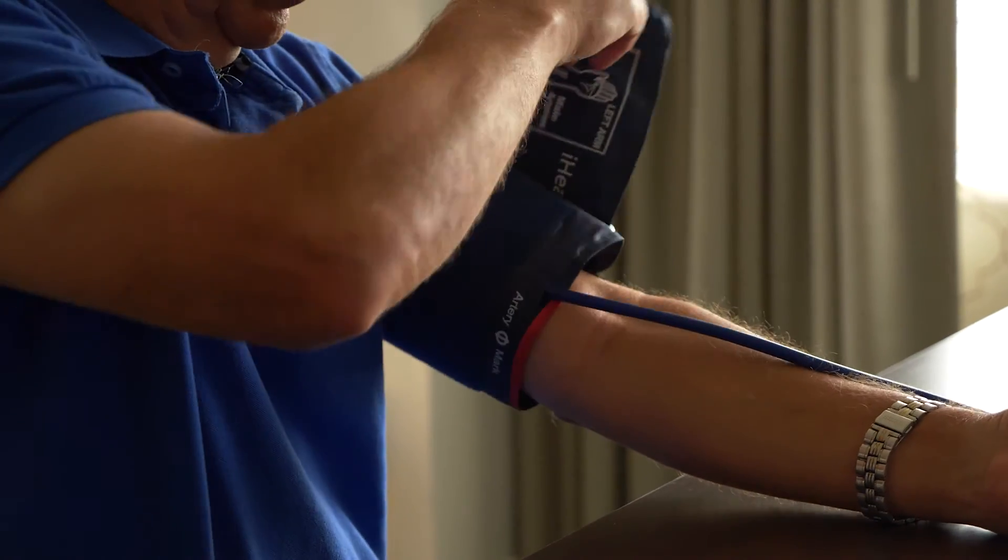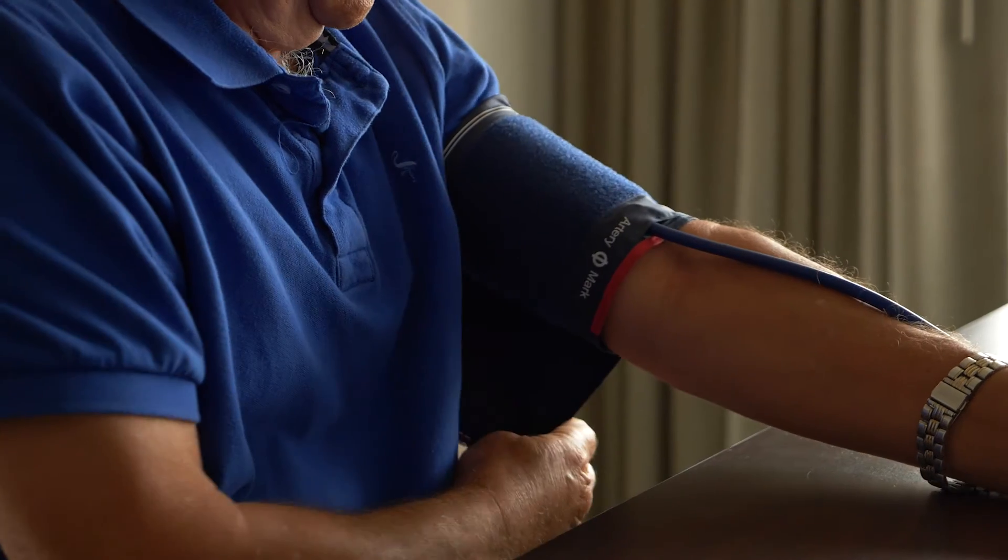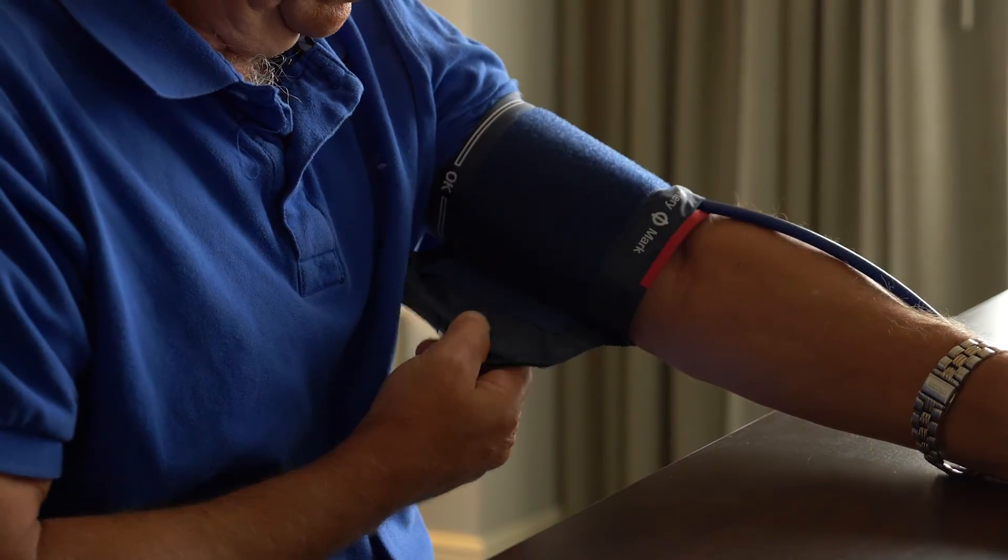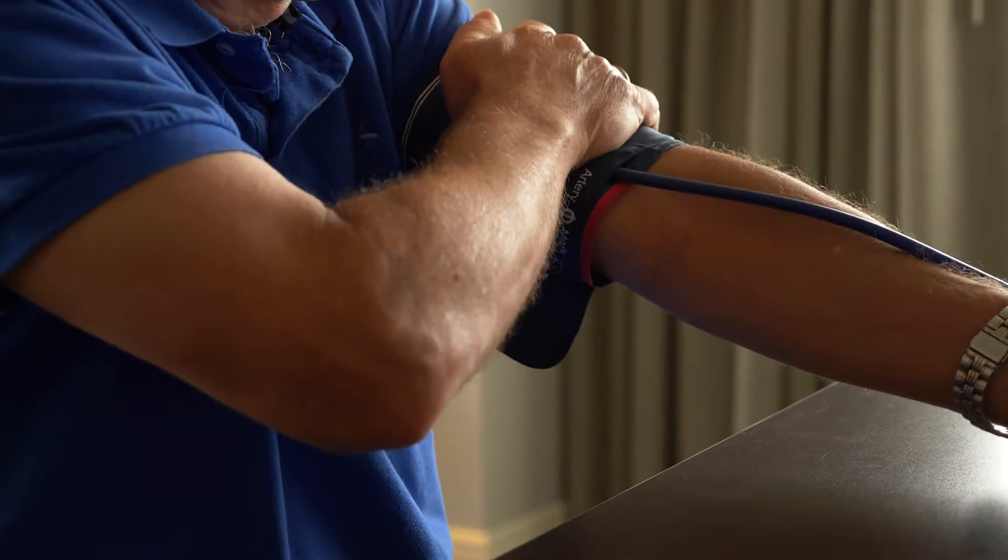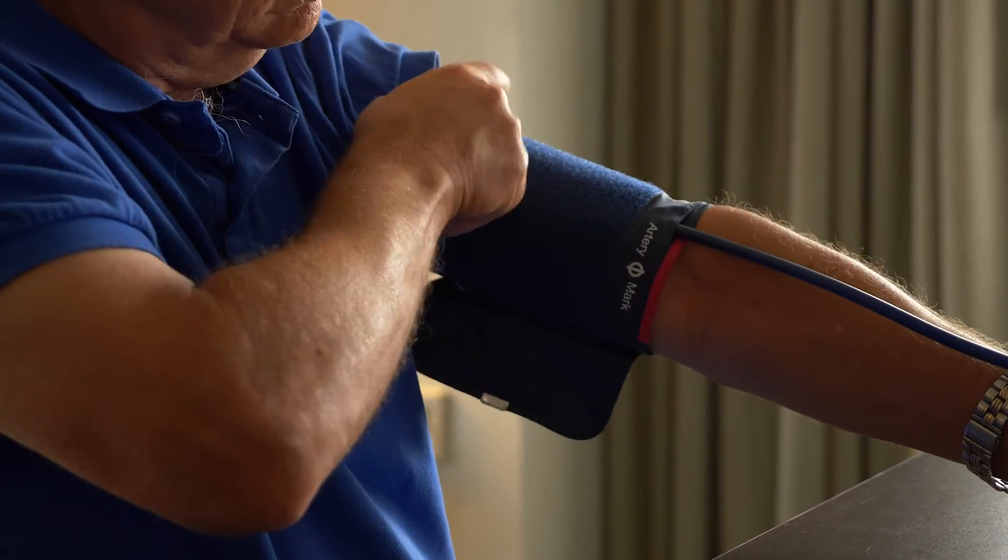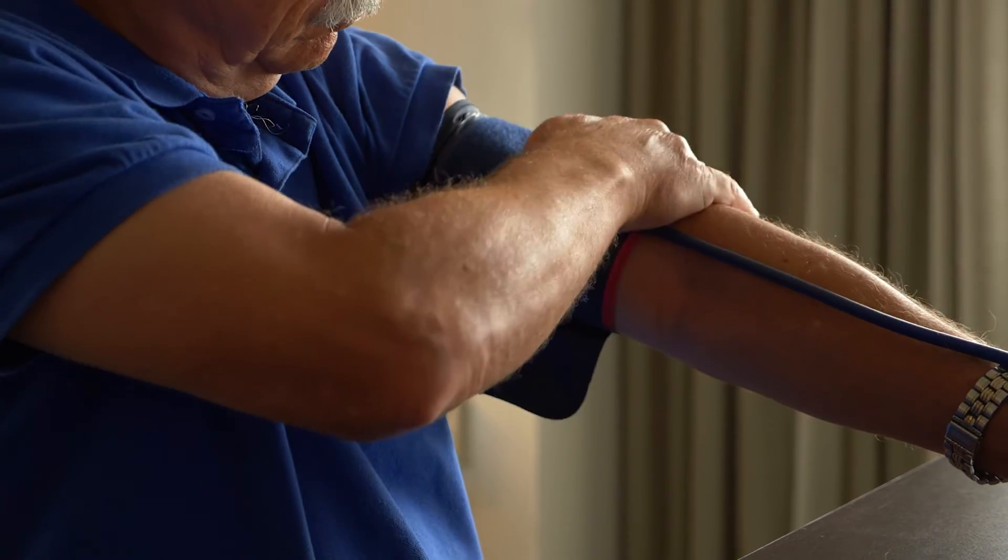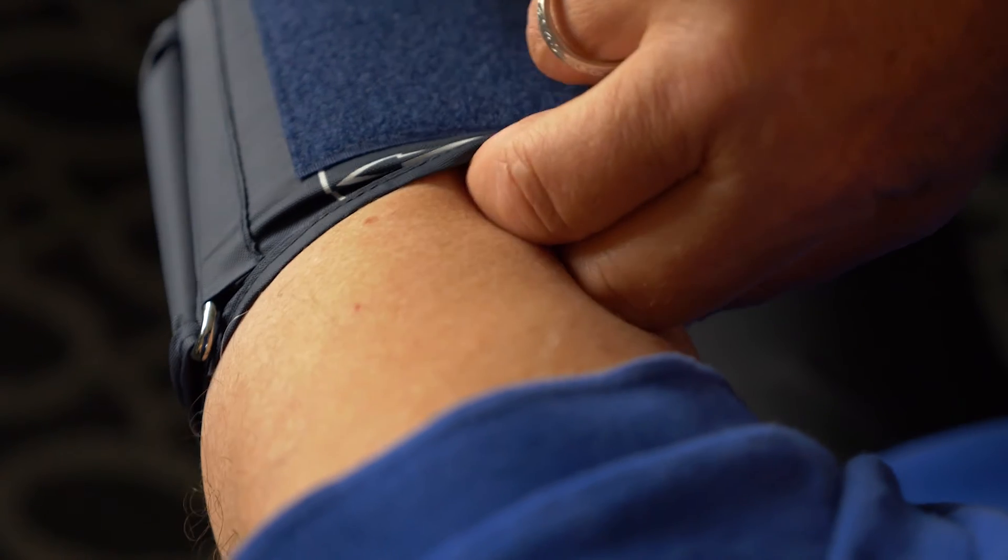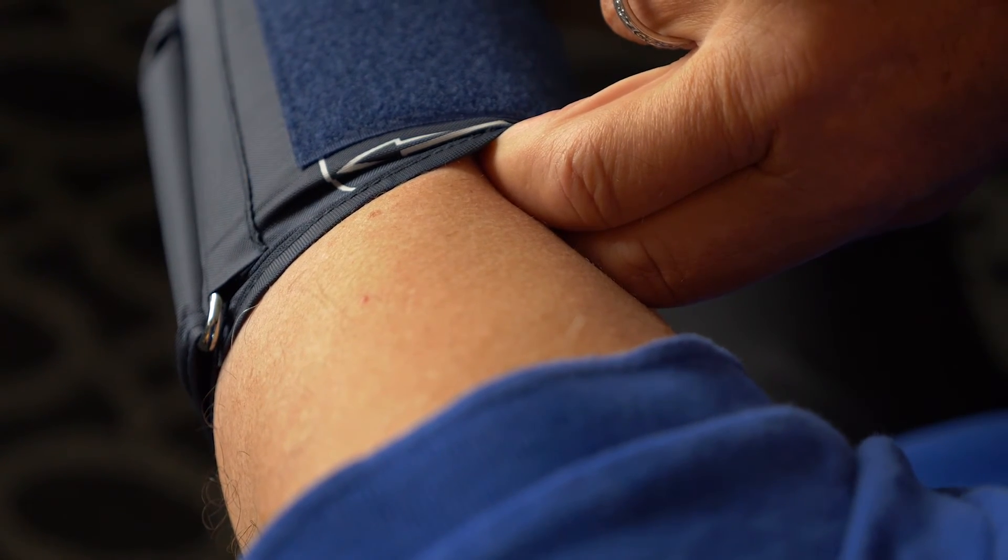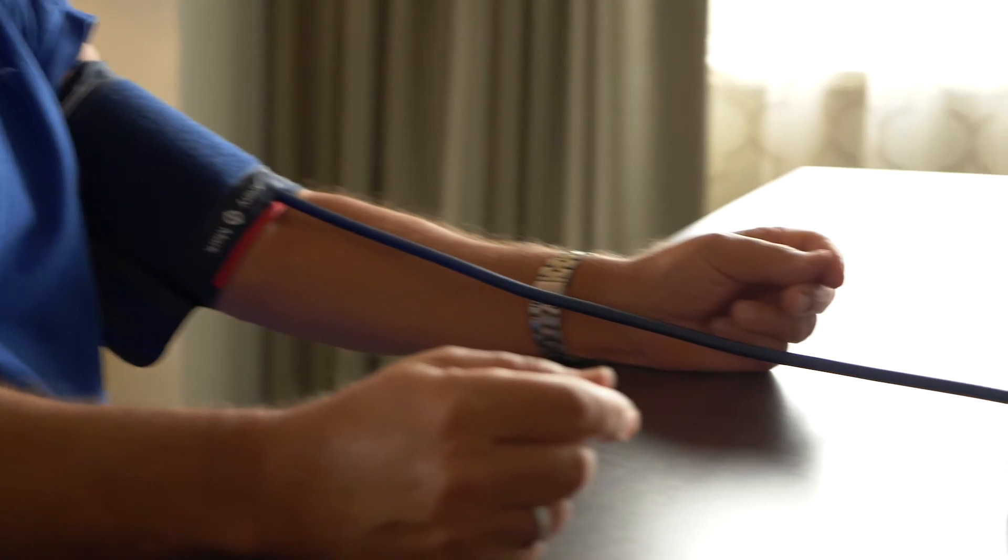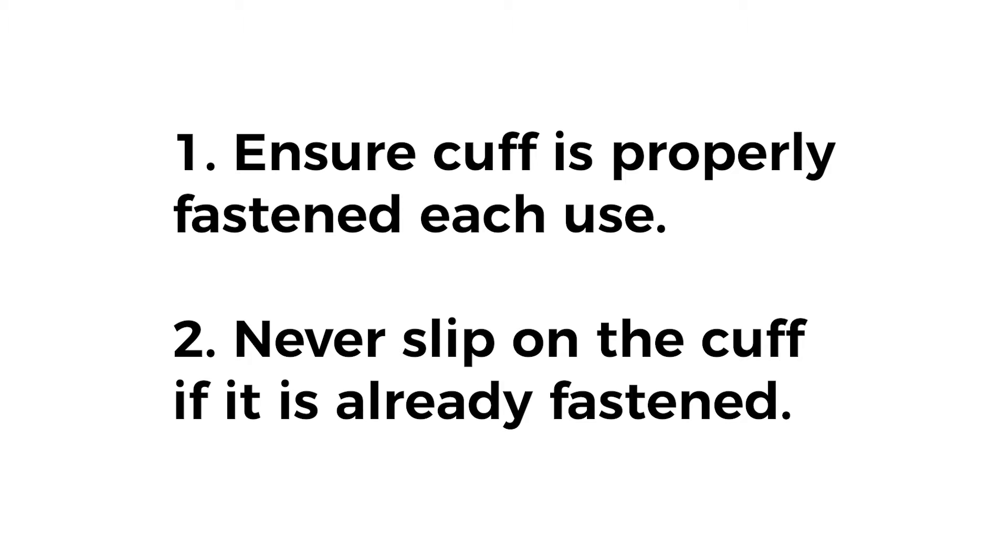Next, position the cuff on your bare upper arm one inch above the bend of your elbow. Pull the end of the cuff so it is evenly tight around your arm and secure the velcro fastener. Make sure the tubing is not coiled or tangled and falls over the front center of your arm. You should place it tight enough so that you can only slip two fingertips side-by-side under the top edge of the cuff. Be sure you fasten the cuff properly each time. Do not slip on the cuff if it is already fastened.